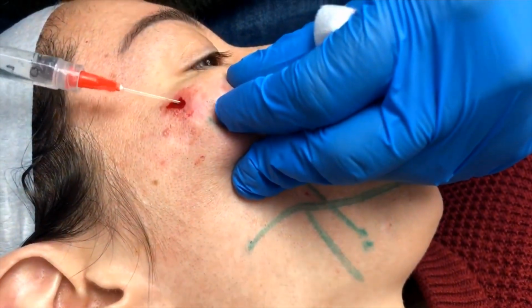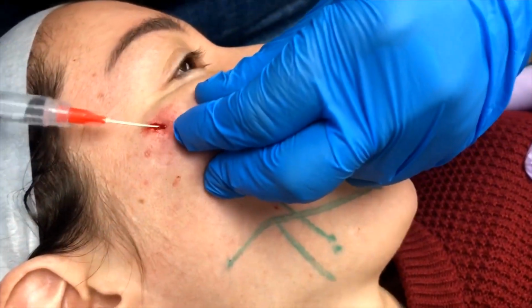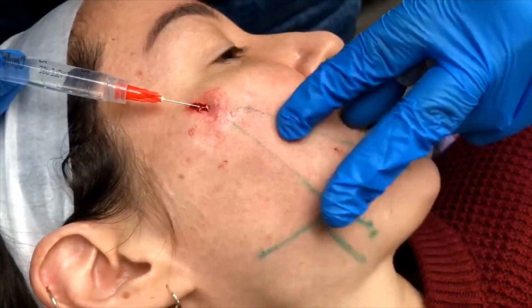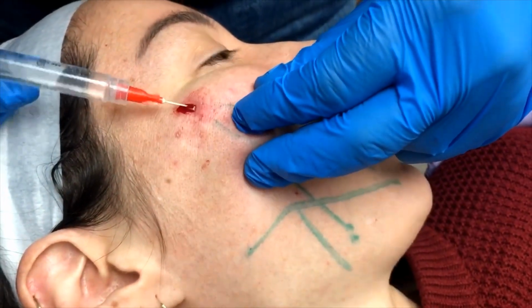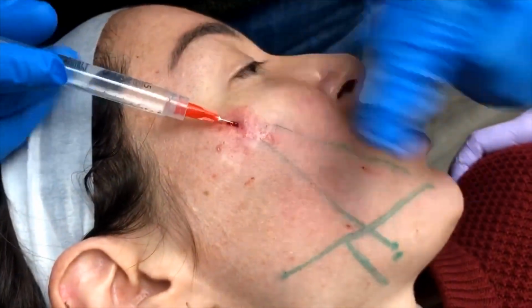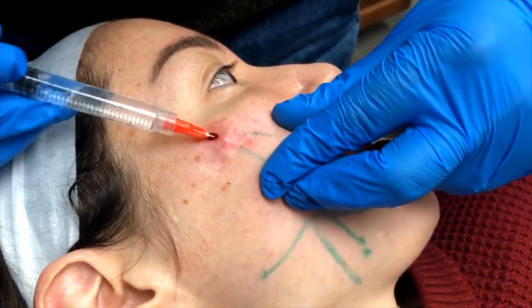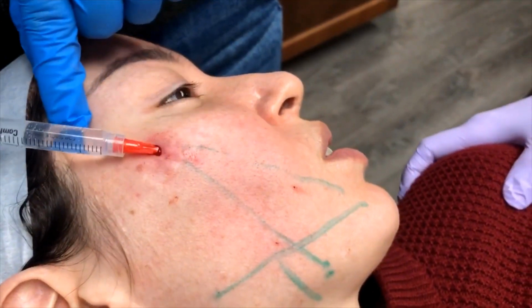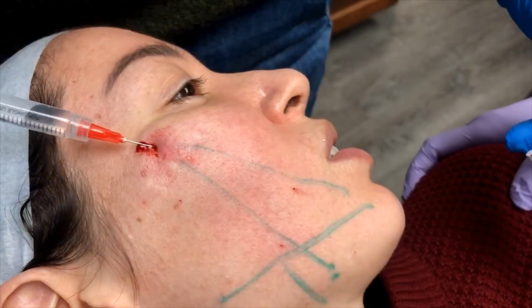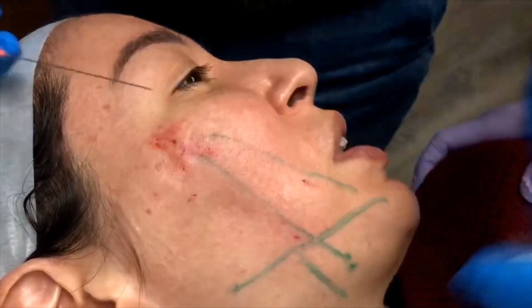If we find that sometimes you've got to push through the ligament just a little bit, but reposition, and all of a sudden you will find yourself going through the areas nice and comfortably. And now we are in the right plane, and that's going to be the same plane that our thread's going to go in. And now we are going to deliver some lidocaine 2% along that track. Not much, very little as we pull this out, just to give the patient lots of comfort here.